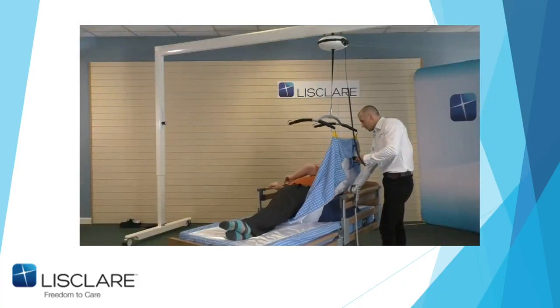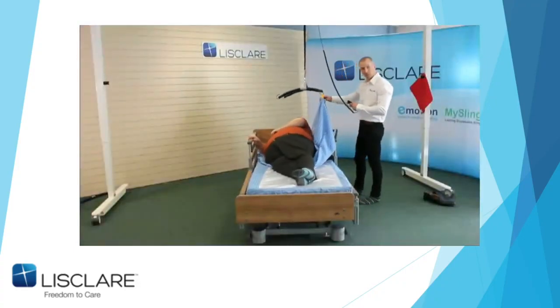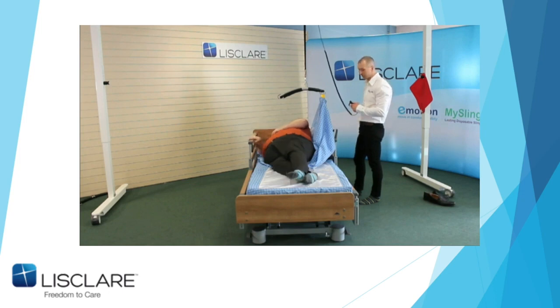And even with my mass, you can see, I don't know whether the camera angle's changed, Ruben. You can see it just won't move. So you could do personal care. Now, normally that would be on a 4-foot bed, so you'd have more room. But it's a good demonstration to show you because I am actually within the weight capacity of this bed. So it should work for me. But again, the ergonomics would be a bit different. So again, there's a quick demonstration of a positive active patient, a negative active patient, and then a passive patient that's bariatric or plus size, whatever you want to prefer.